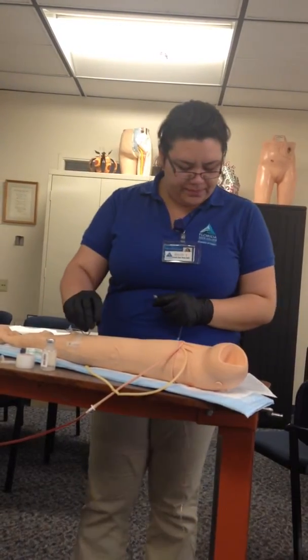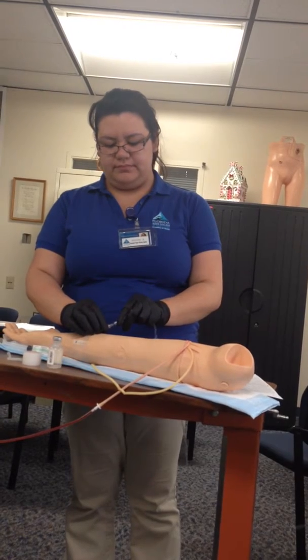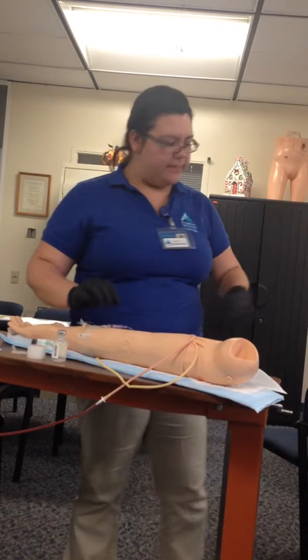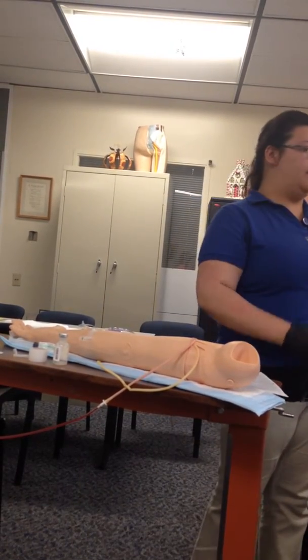Alcohol. Establish the flow rate. It's going to be 8 drops per minute.